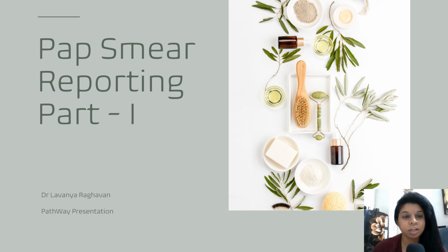And today I thought we will start a new series of classes, something which is important for your practical purposes. So, as I'm posted in cytology, I thought I will start with cytological topics. So, I thought we'll start on one of my favorite topics, that is pap smear reporting. I'll be doing it in parts because the slides are way too much. Firstly, I'll be telling about the non-neoplastic part and then about the organisms that are seen in the pap smear. And then we will go to the atypical and neoplastic parts. Okay.